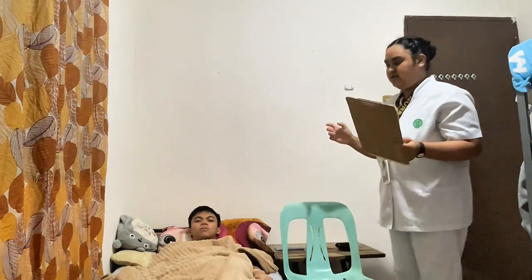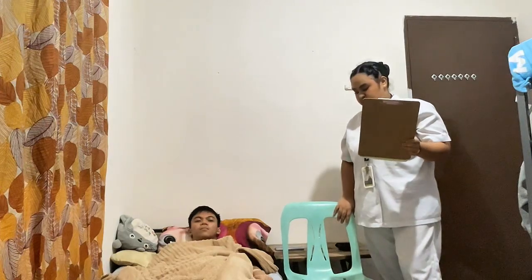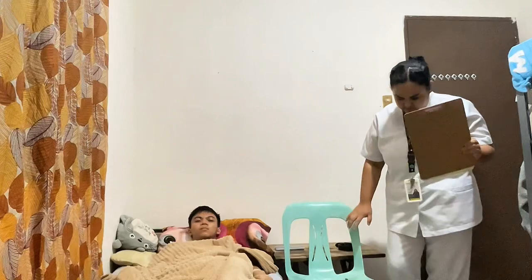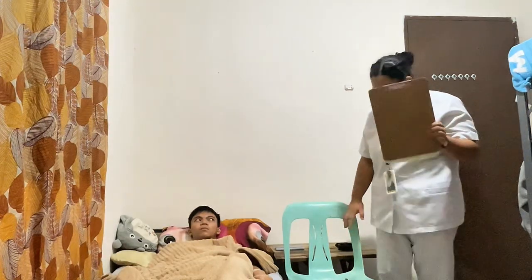So next is to obtain the equipments needed. But since I will use a chair, I will check the condition of it just for the safety of the patient. So I already obtained the equipments needed and checked its condition. I will now inform the client about the desired purpose and the destination. This is to prevent the client's anxiety and increase cooperation.